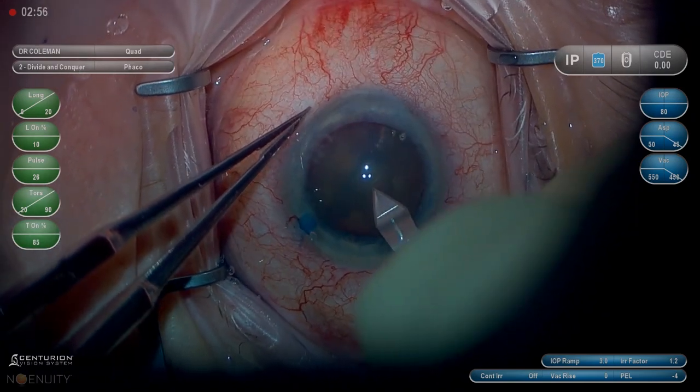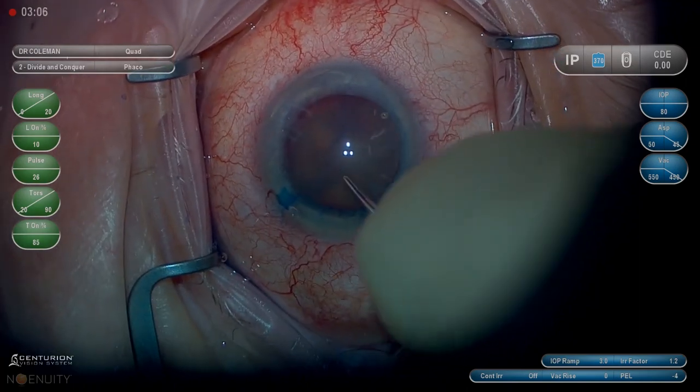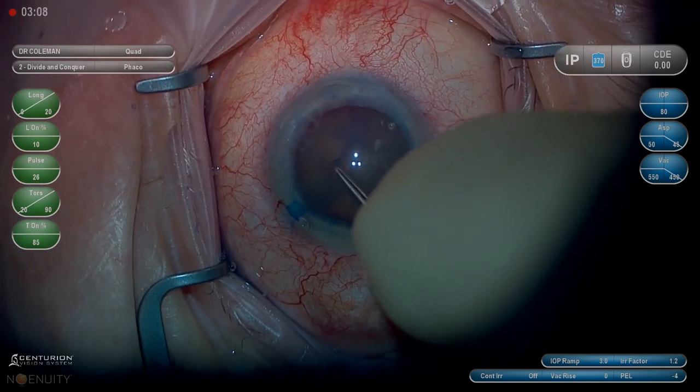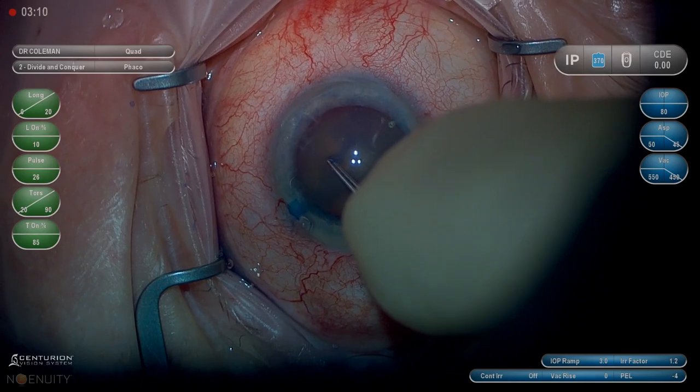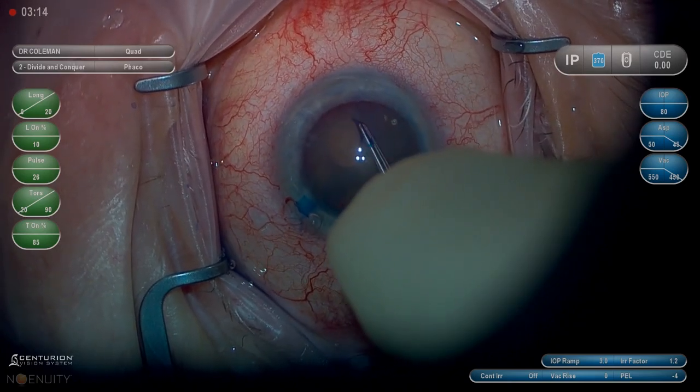I like to puncture the capsule with my keratome to create a very definite point to begin my capsulorrhexis. On these dense cataracts, we have to make sure that it doesn't tear out. A lot of times it has a tendency to, but this one seems to be fairly well controlled.